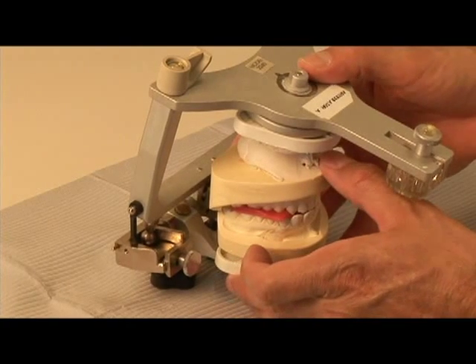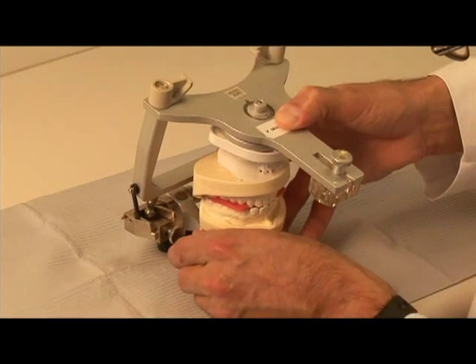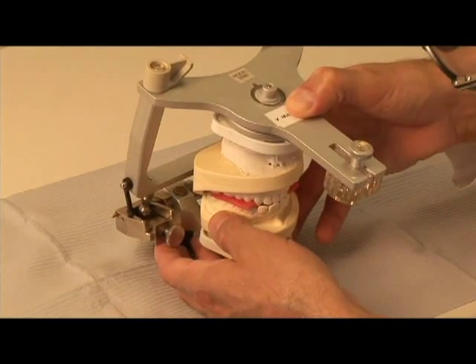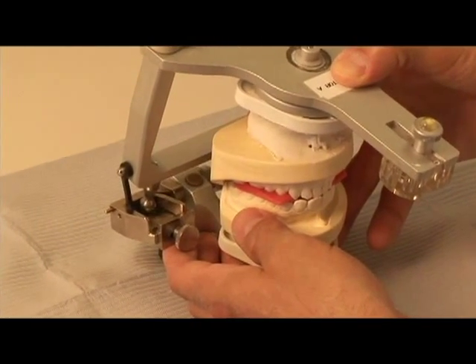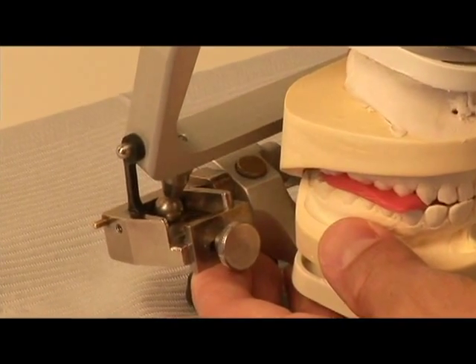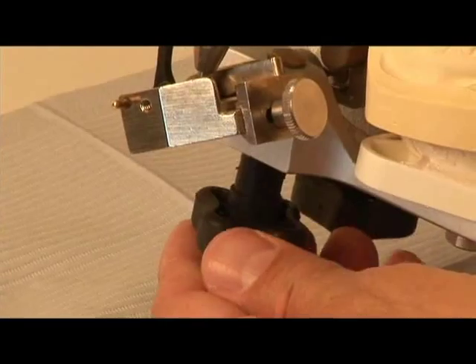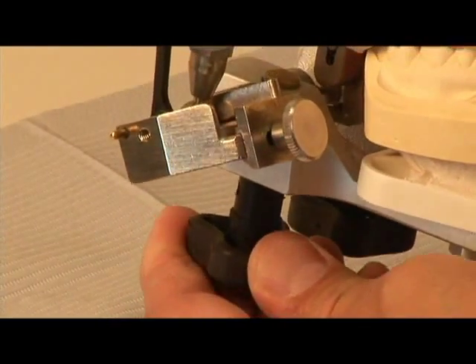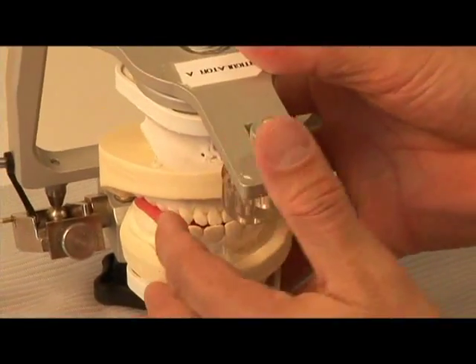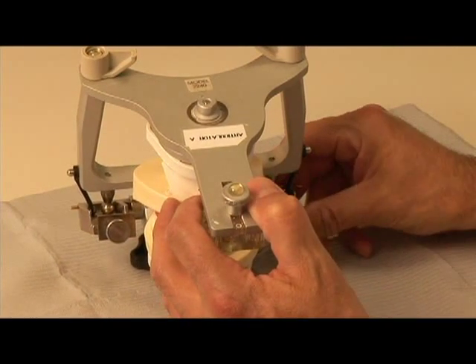Make sure that the protrusive record is fully seated, then check for space between the superior wall and the condylar element. If space is present, carefully rotate the condylar guide element up until it touches the condylar ball. It is recommended that you do this by both tactile and visual observation. Tighten the clamp knob on that side. Perform the same procedure on the opposite side and then tighten the clamp knob screw on that side as well.